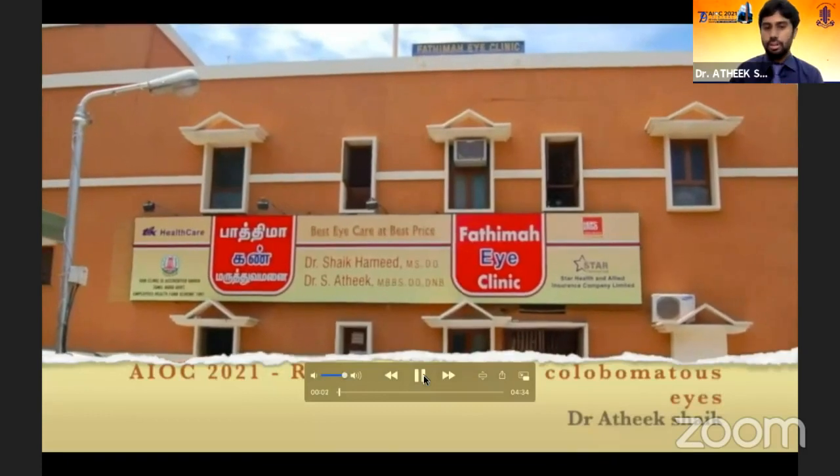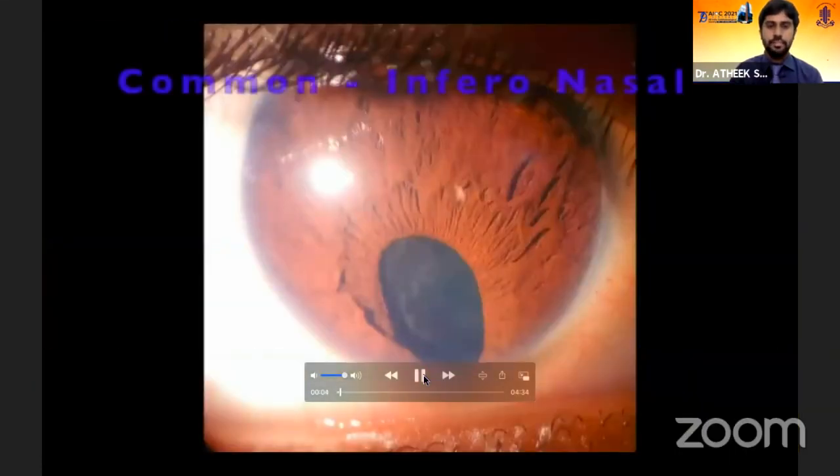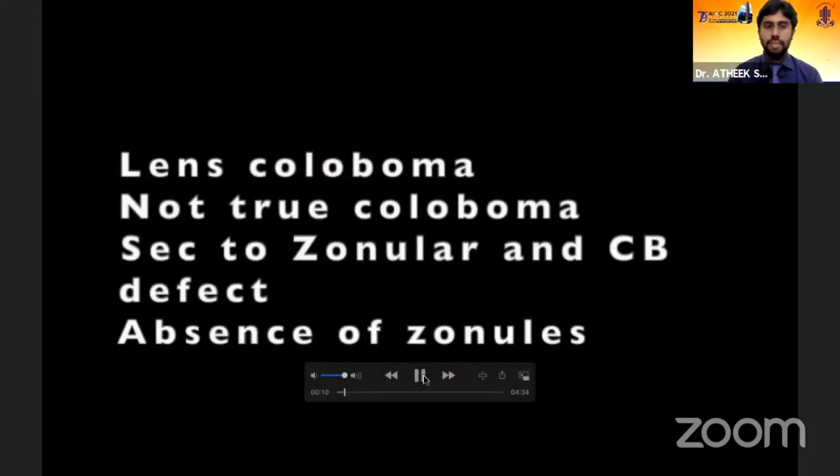Well, I'm going to talk on phaco in colobomatosis. Here we are planning to stick to only congenital colobomas. The common ones that we usually see are the inferonasal iris colobomas. Colobomas in other locations are very rare, and sometimes they can be associated with lens colobomas.